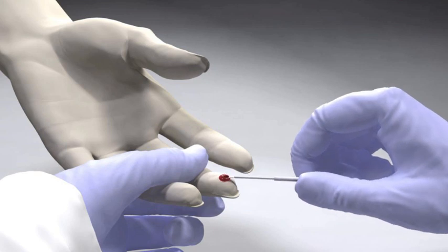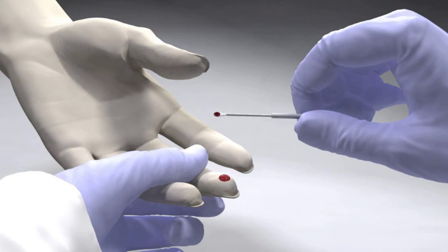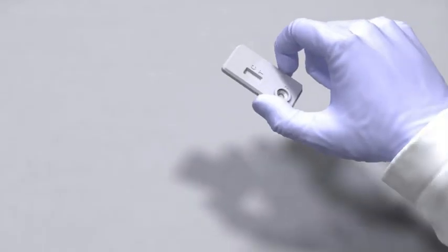If you're taking a sample from venous blood, serum, or plasma drawn tube, you can use the 5 microliter sampling loop or a lab pipette that can deliver 5 microliters.